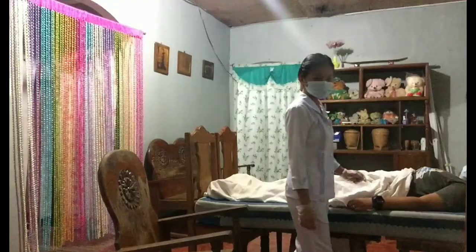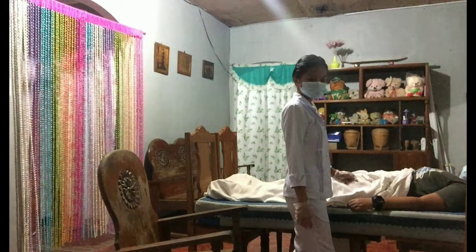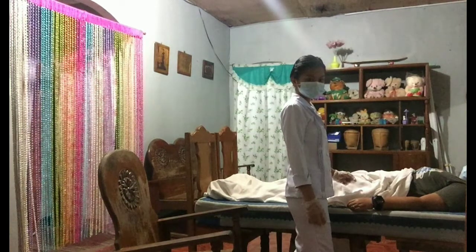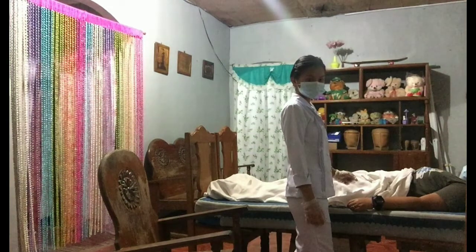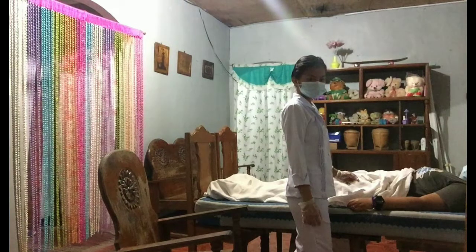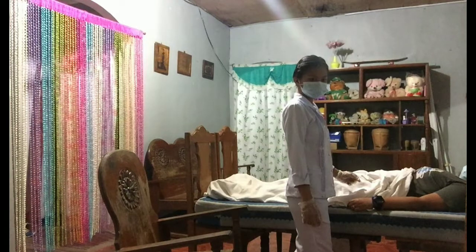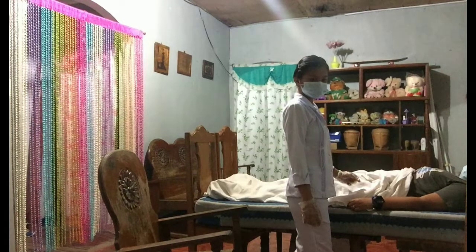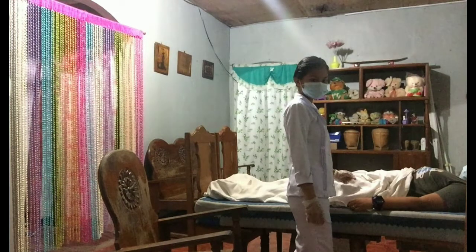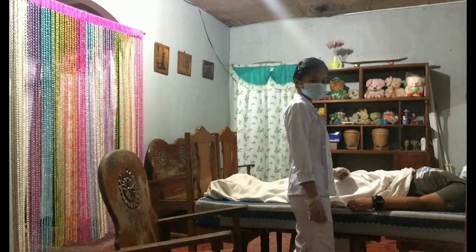The first step in transferring the client from bed to wheelchair is to make sure the bed brakes are locked. Put the wheelchair next to the bed facing the foot of the bed. If available, lock the brakes of the chair; if the chair does not have brakes, brace the chair against a secure object. Place the bed in the lowest position.